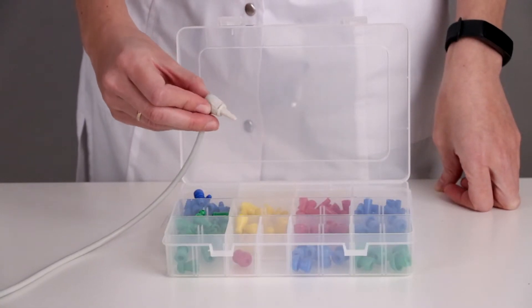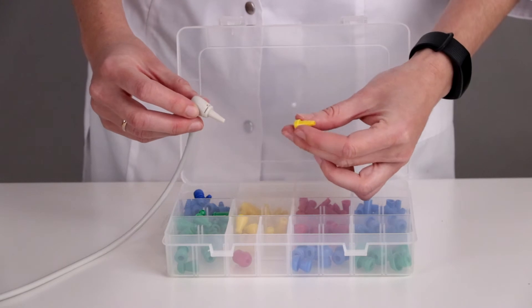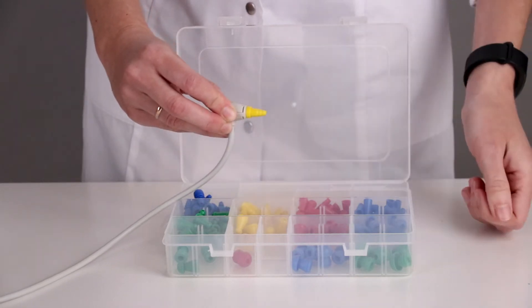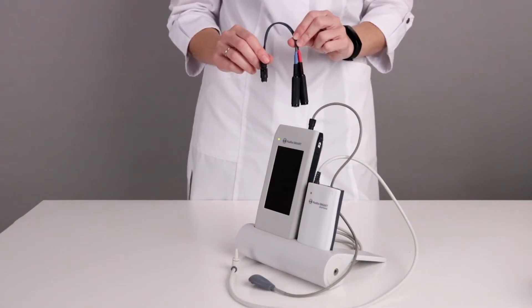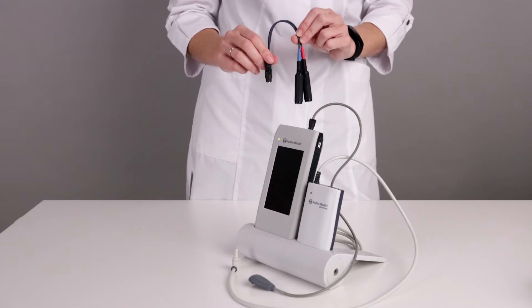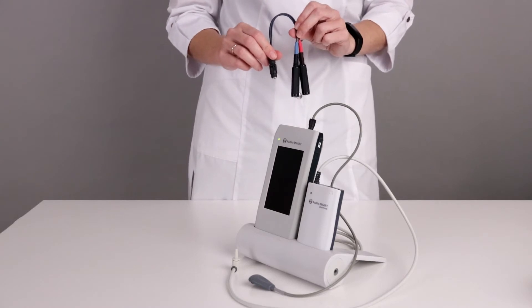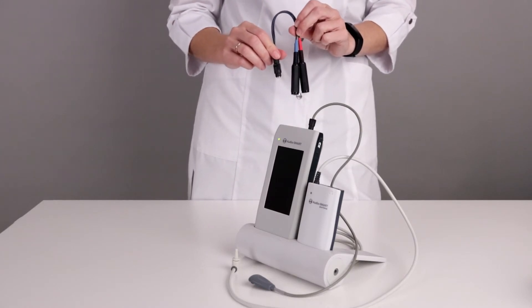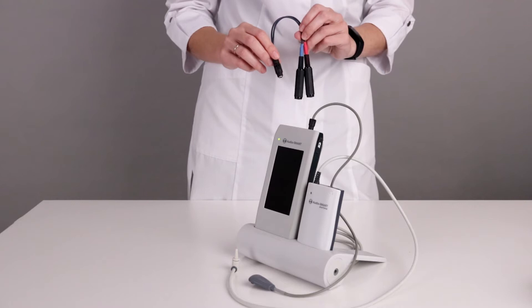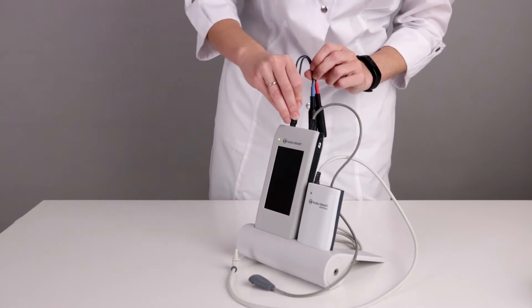When we use the probe as a stimulator, we need to choose the proper size and form of the probe tip and put it tightly on the probe. In some cases — for example, when we need to deliver the stimulus at high intensity — it can't be delivered using the probe. We can also use different types of stimulators: for example, headphones TDH39 or insert earphones. In such cases, we need to connect them to the AudioSmart using a special adapter.